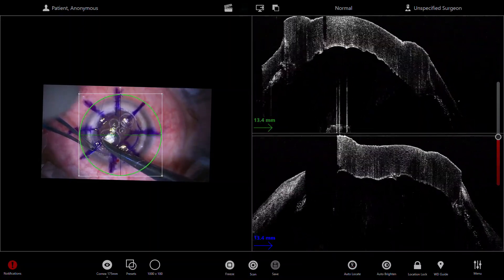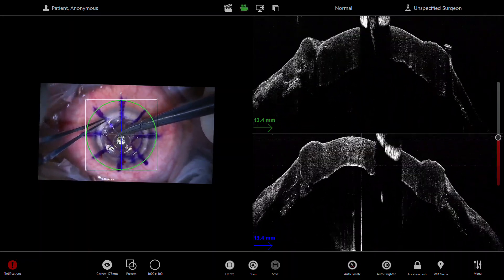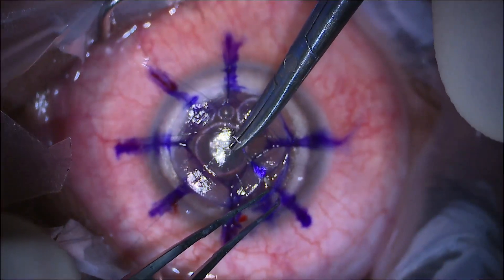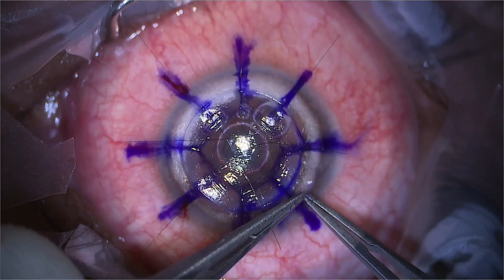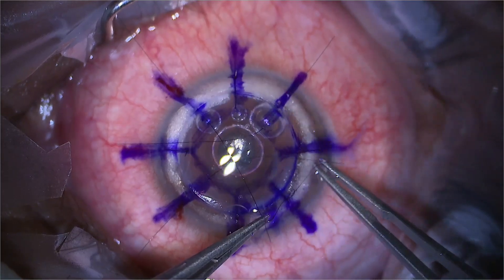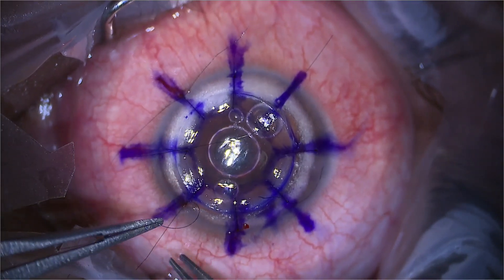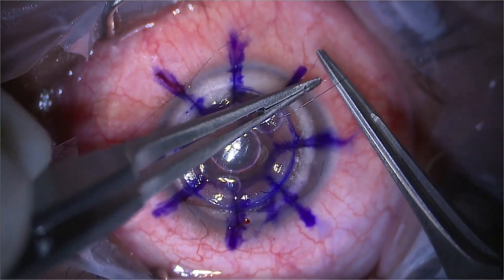I do mix between having continuous and interrupted sutures — here's an example of interrupted sutures, as this is a case where I was teaching and the fellow was doing some other suturing as well. Suturing is extremely important in DALK or in any graft, and it's crucial that each suture is as equal to the other as possible. The tendency is sometimes to progressively go tighter with each suture, which means that when you come back to the first ones they often become loose. Overtight sutures are just as bad as loose sutures, so tension is really important. You can see how much tension there is in the graft when you look at the OCT at the end.